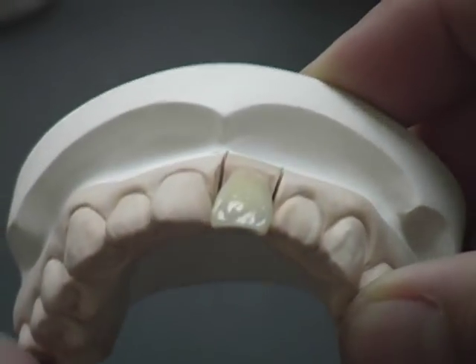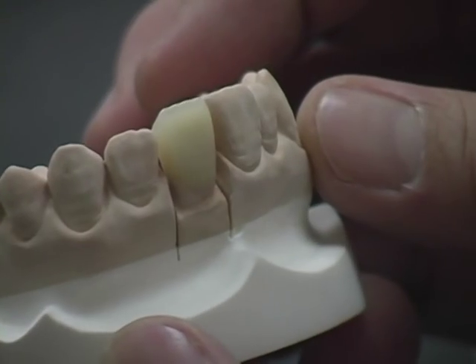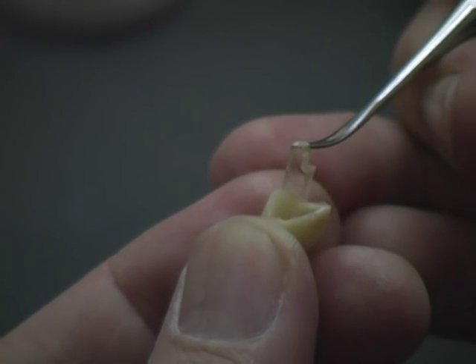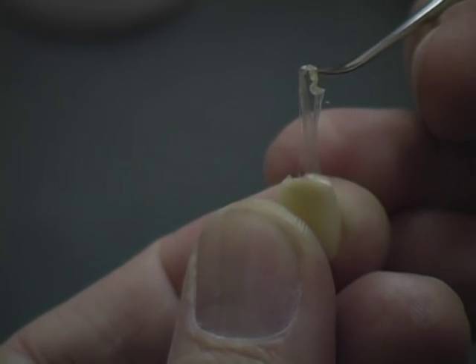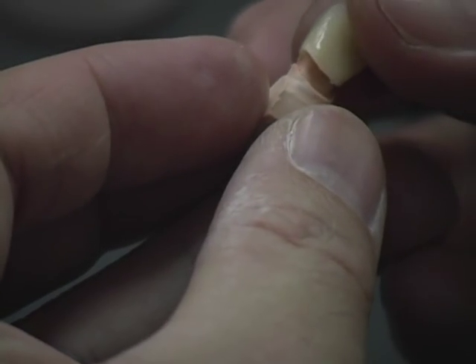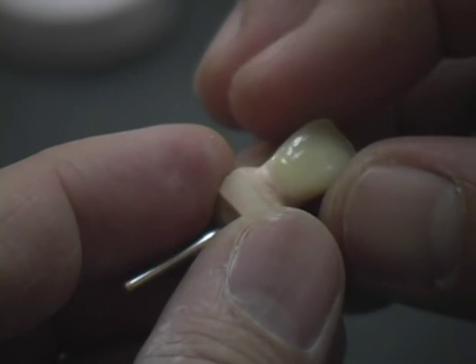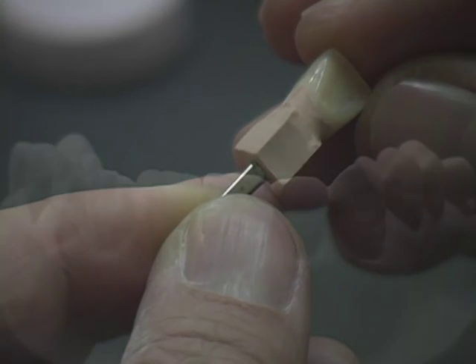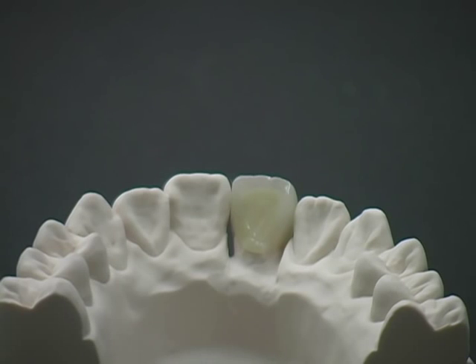The completed restoration achieves porcelain-like aesthetics and natural translucency. Separate the single crown from the die and remove the spacer easily. Place the crown back on the die to confirm the margins. The dentine and enamel can be clearly demarcated, similar to natural teeth, with a glaze-like final polish.